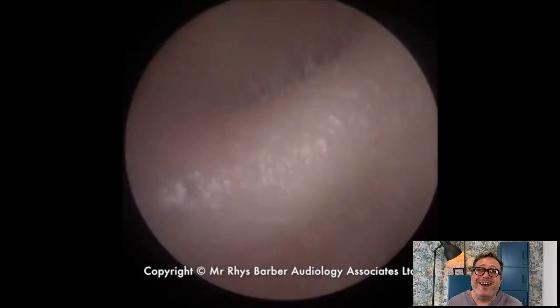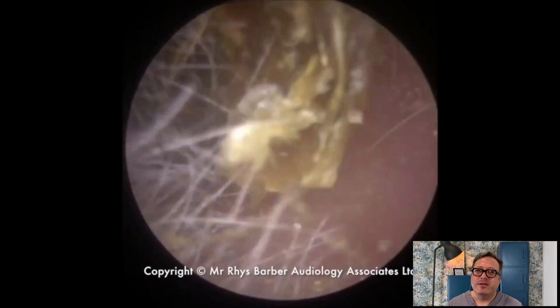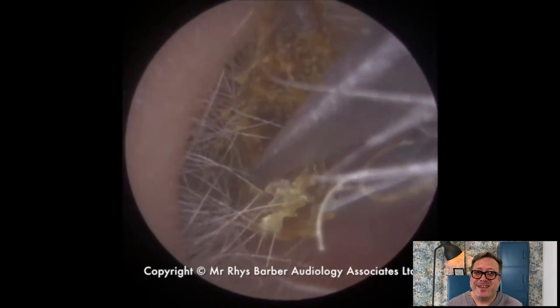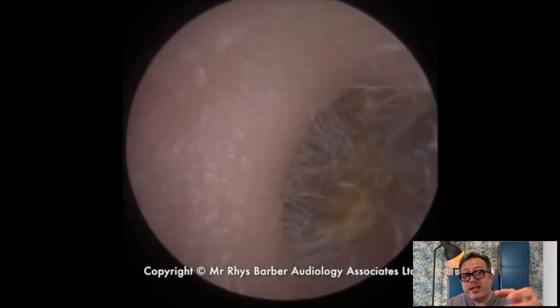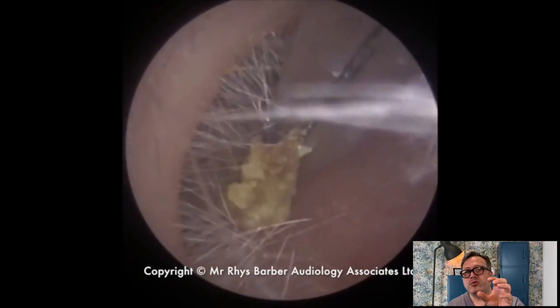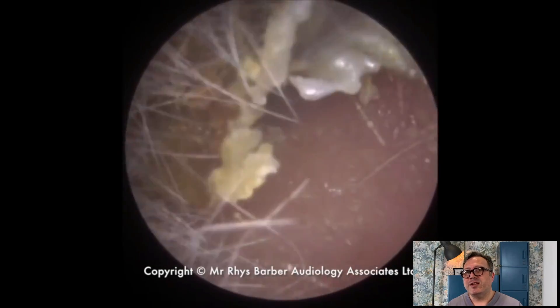Well done — got that bit out. Let's try and take that bit away with the forceps. I think we just got a hold of a couple of little hairs — there we go, it's almost out. Get the grip — there we go, almost there. You can see the layers — look how that's pulling forwards. The resistance as we pull it out is drawing that deeper section down as well. I'm trying to keep the grip but not hold on too tightly because otherwise it breaks away — it's always a difficult one with these dry plates.